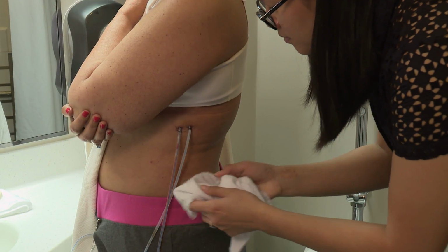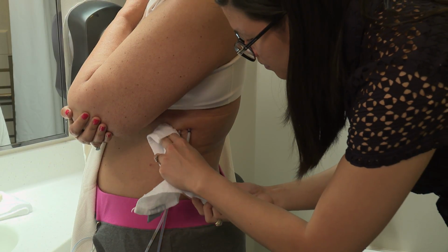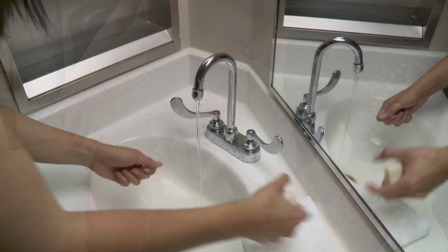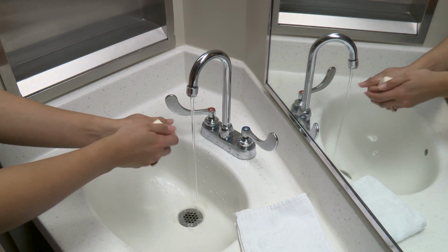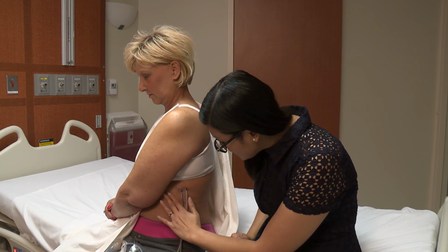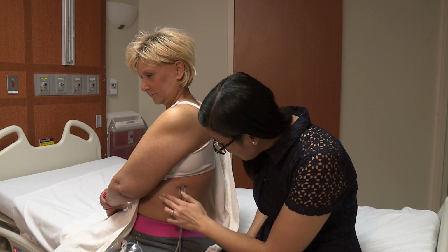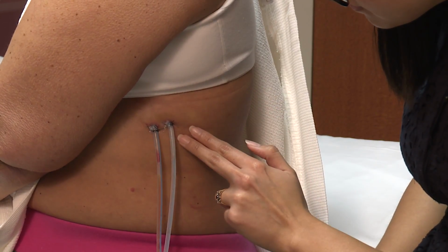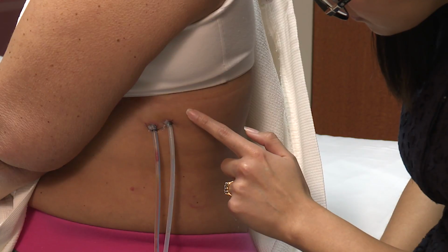If you are unable to shower, clean the drain insertion site with soap and water at least one time each day. You and your caregiver should always wash your hands first. Begin by inspecting the incision and drain insertion sites. Do this at least one time each day. Make a note of any changes in color or swelling at the incision or drain insertion sites.